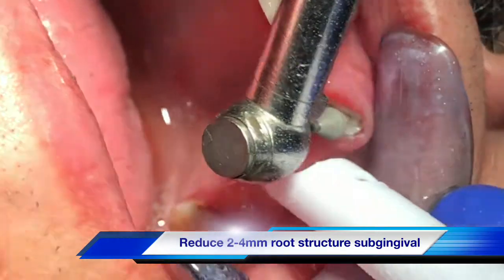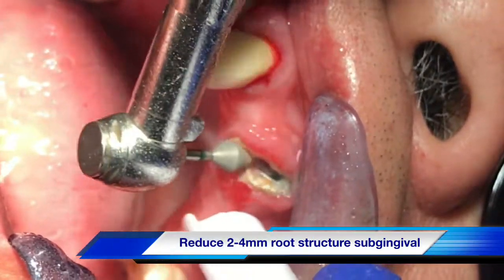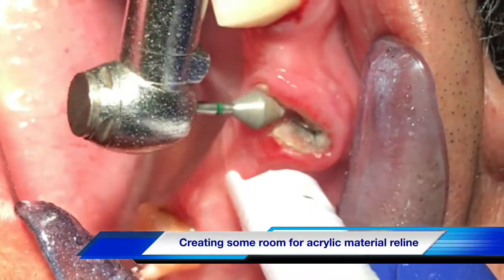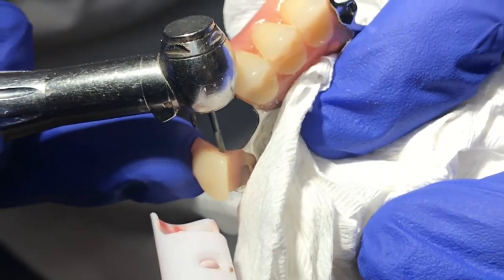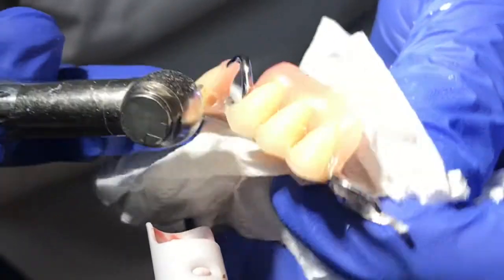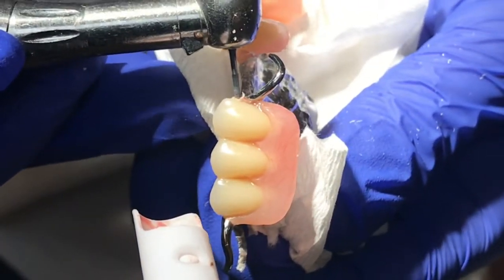What I will show you in this particular case is how to add that tooth number 11 onto the denture, and extract the tooth on the same-day visit if you have time, and deliver the denture on the same visit. The next step is to create the mesial retention groove from tooth number 12 and the distal retention groove from tooth number 10.